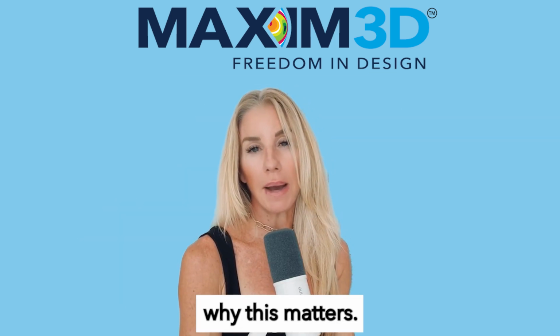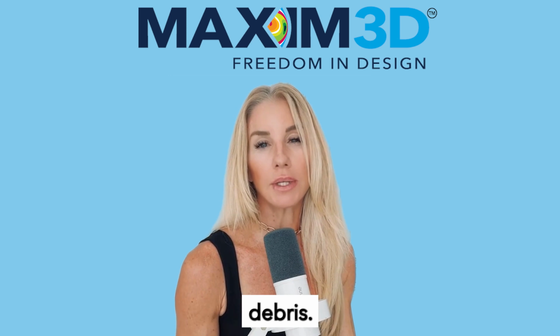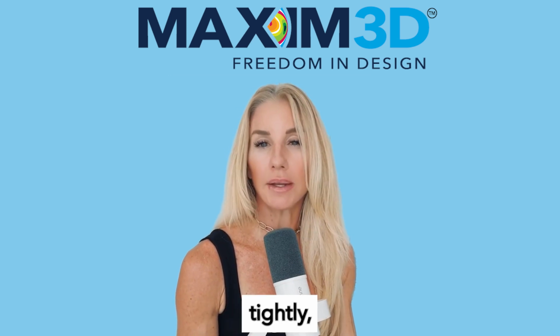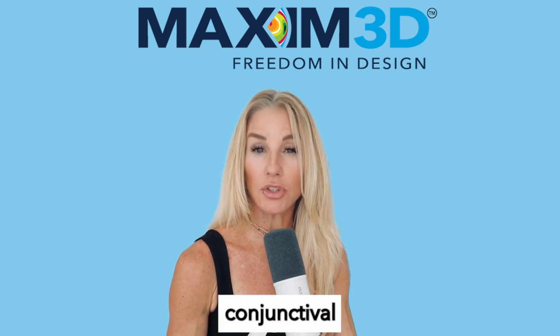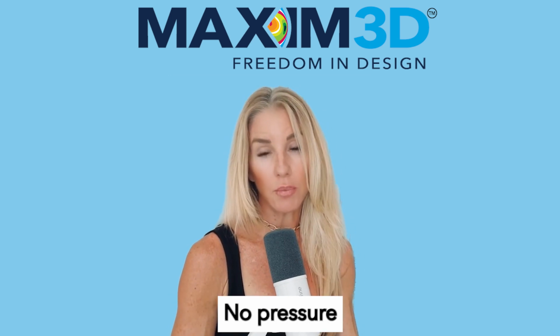Here is why this matters. A flat edge compromises lens stability and invites debris. A steep edge seals too tightly, limiting oxygen and damaging conjunctival tissue. The goal is a stable, flush landing. No lift, no pressure points.